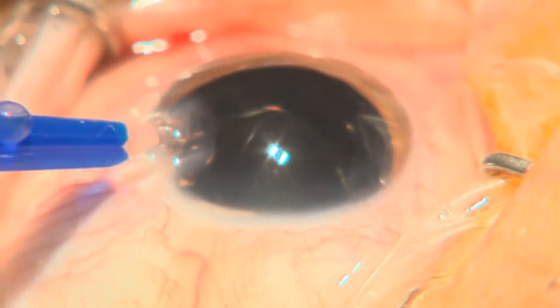I'd like to stress that the injector cartridge comes out smoothly, thereby effectively preserving lens transparency. I've seen no scratches on biflex lenses inserted into the capsular bag, despite this being a common occurrence with other types of intraocular lenses.